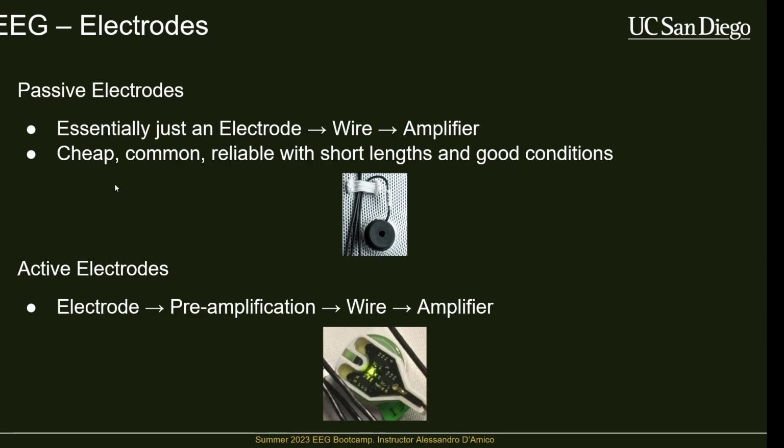These are very cheap to produce. They're really common. They're really reliable as long as your cables aren't too long. As your cables get longer, you get effects from wire sway. So as the subject moves around or the wires sway, that'll cause some disturbances. But also, the longer your wire gets, the more it acts like an antenna for other noise.